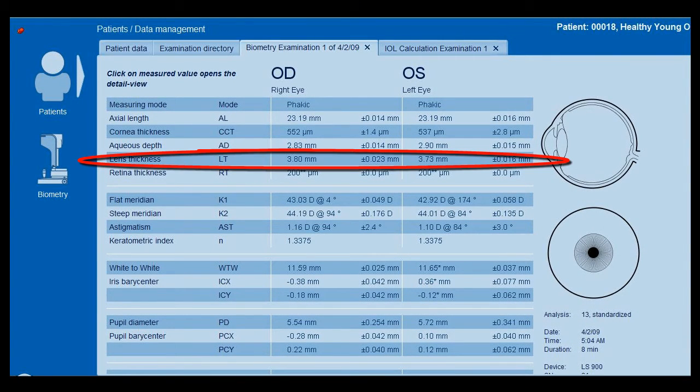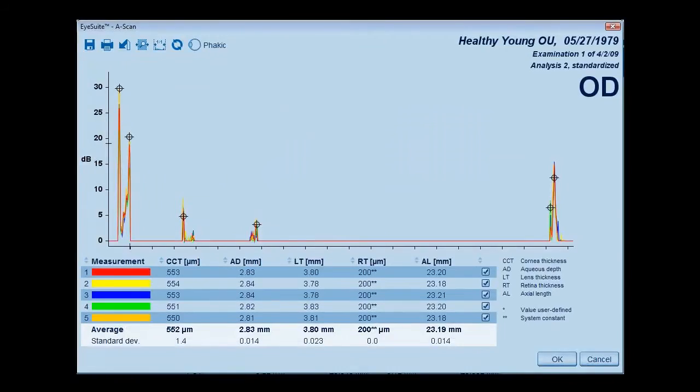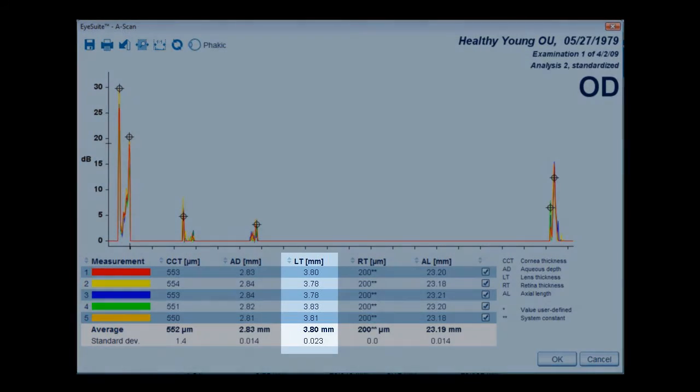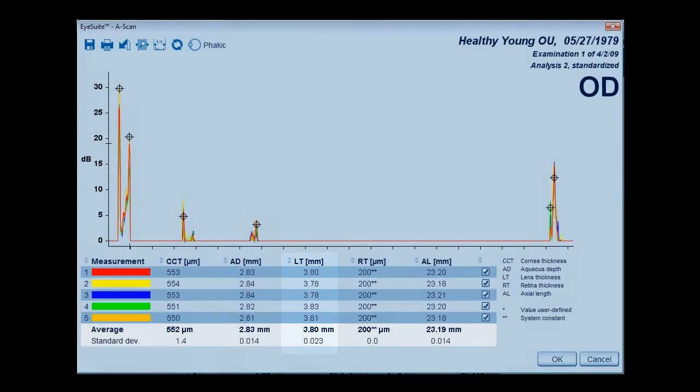By selecting any of the lens thickness values, the physician can open a new window displaying all of the individual lens thickness measurements from the biometry acquisition. From this screen, the user may select individual measurements to evaluate independently.